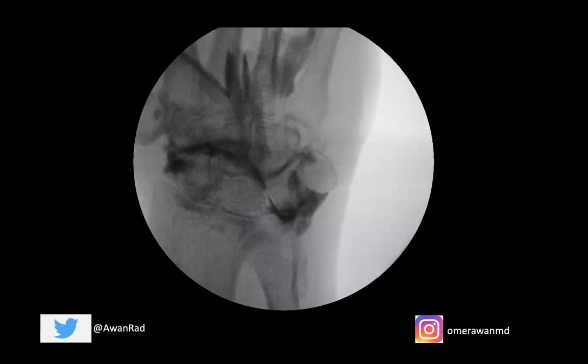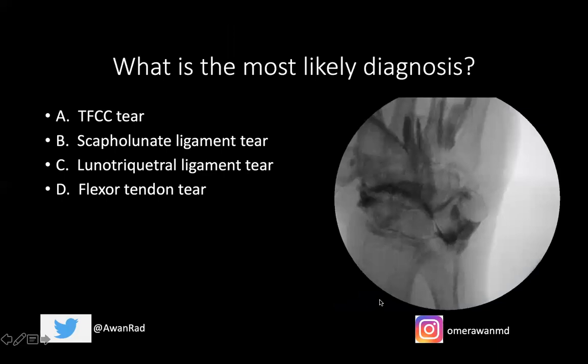The question I have for all of you is: what's the most likely diagnosis we see here? Is this an example of a TFCC tear — a triangular fibrocartilaginous complex tear — a scapholunate ligament tear, a lunotriquetral ligament tear, or a flexor tendon tear?